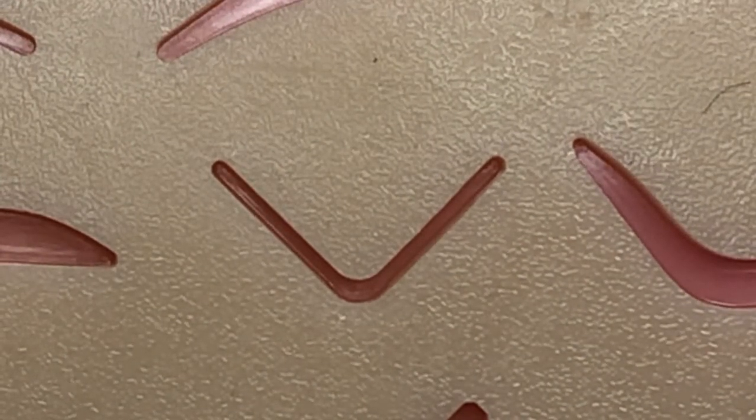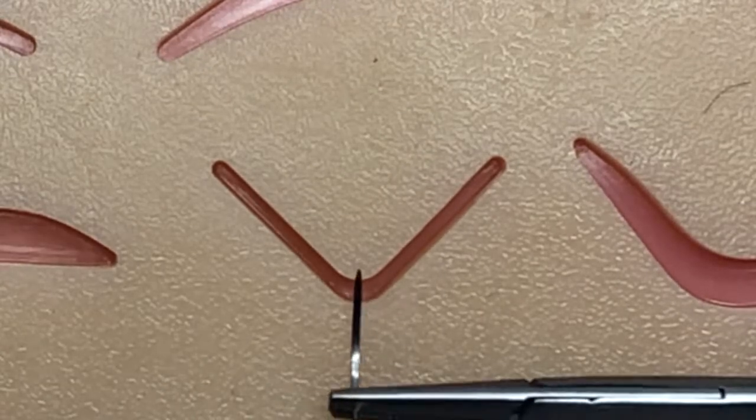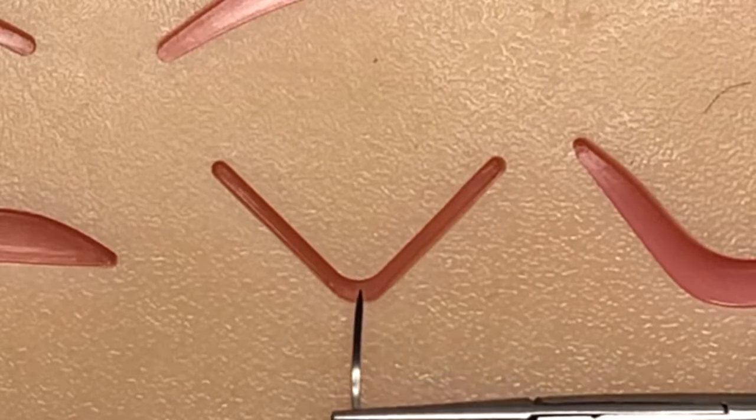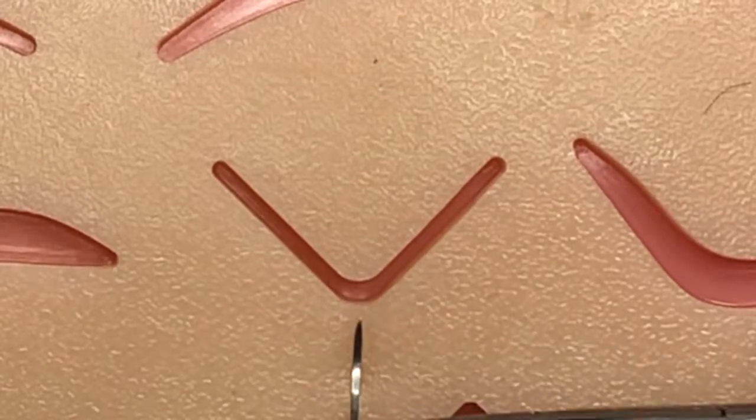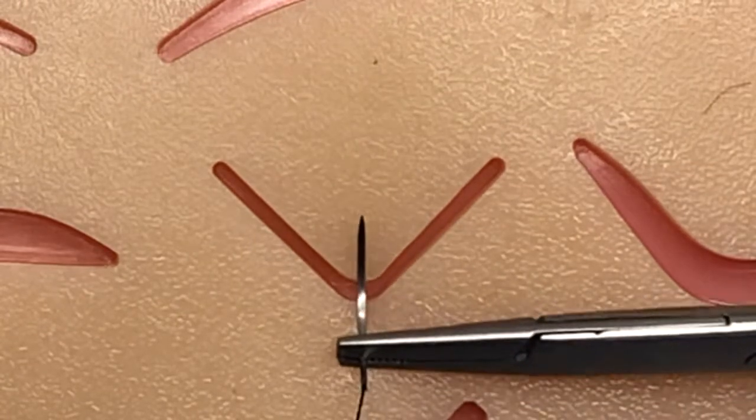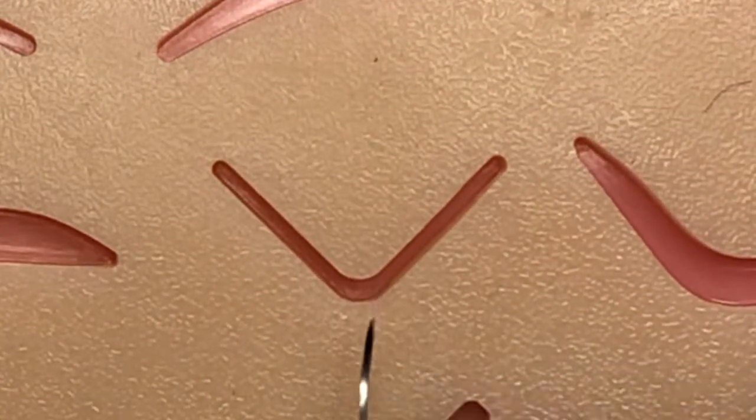And you can do this in two ways. If you don't have that much tissue to work with, you can put just a simple tacking suture down right here, just to bring that together at the apex.